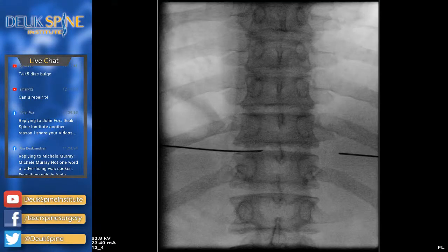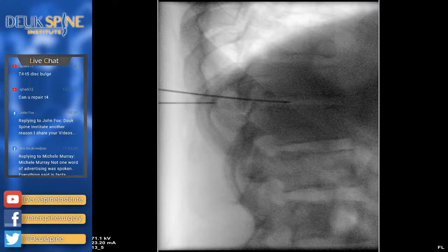And we talked about this earlier. You're a little bit off-centered, but I think we're fine for now. But when you come back, try to get the spinous process a little bit more perfect, maybe a degree of rotation. But for right now, let's go back to a lateral. So navigation can only be as good as the tools and the information used to navigate. All right. And we're creating a map right now with this patient and the x-ray machine.